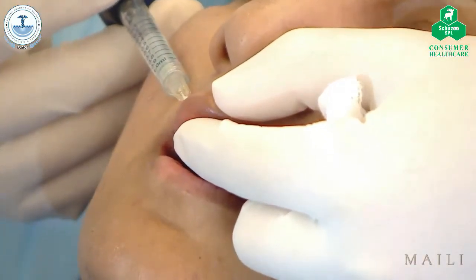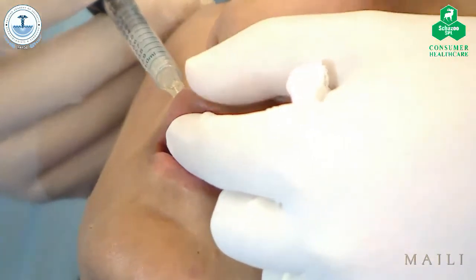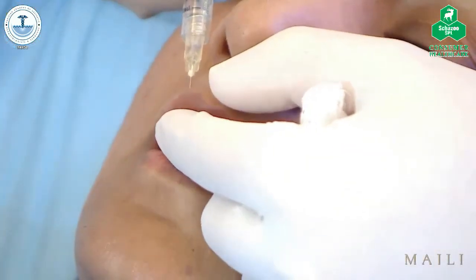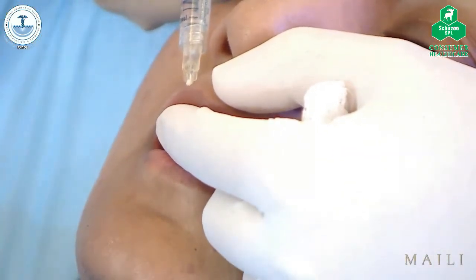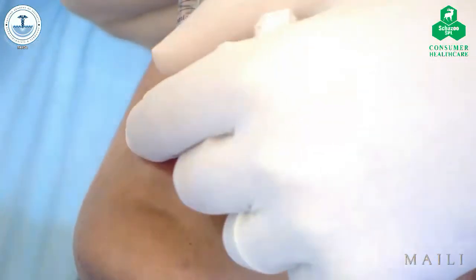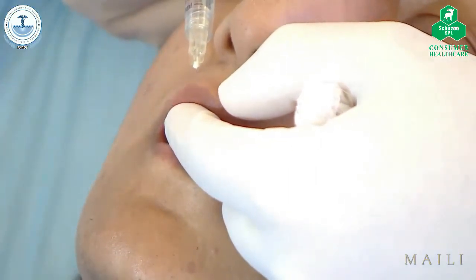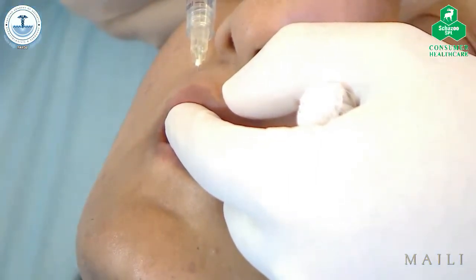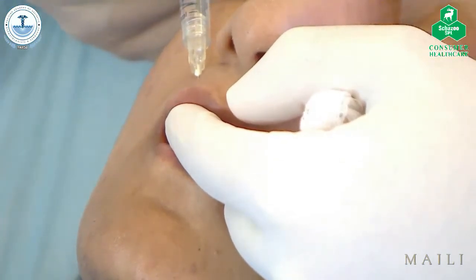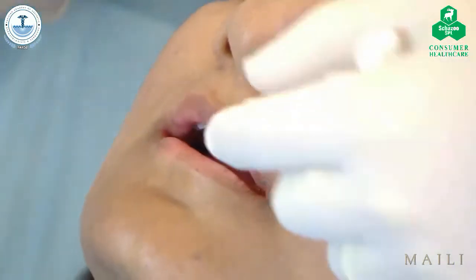It's important that you keep your eye constantly on the scale. And then, without taking the needle out, I'm just going to go down to the mid part. Again, you can see the needle is in the back there. You can see me pushing it. My finger is just there to control the depth. And I put another small bolus, like 0.05. I'm not pushing the needle out. I'm injecting a bolus where I have the tip, okay? And I take it out.